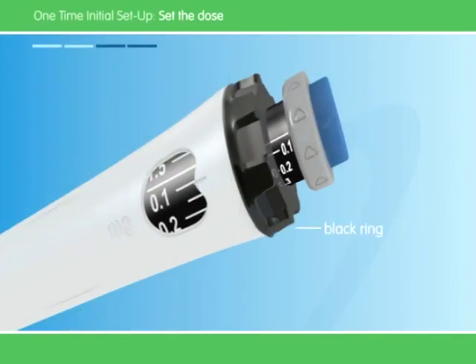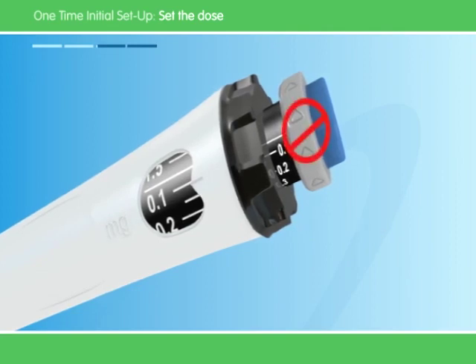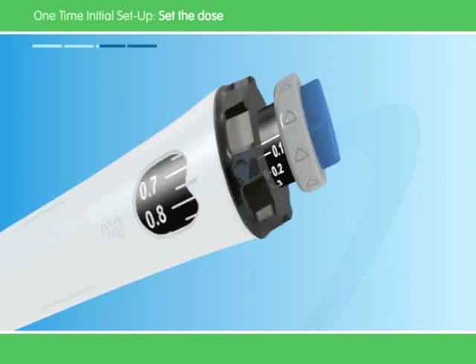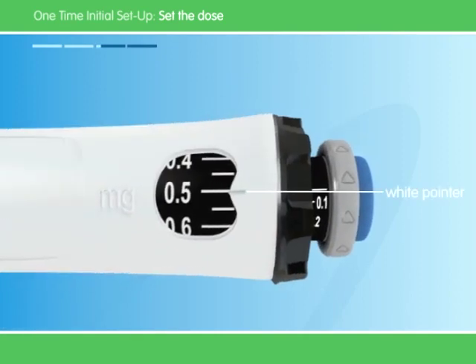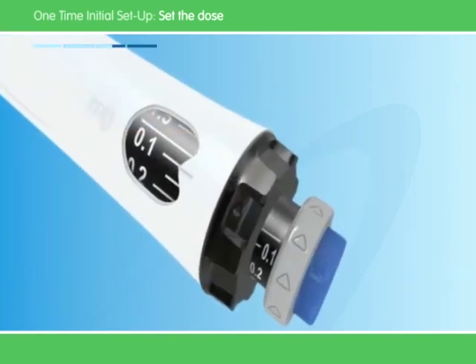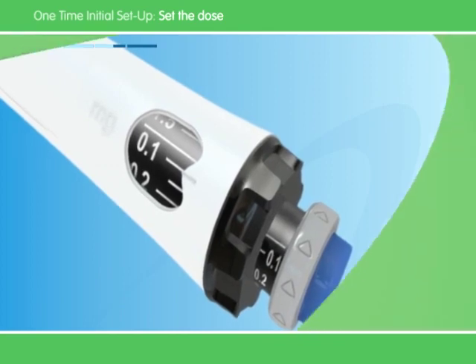Next, you must set the dose of the pen by turning the black ring. Take care not to turn the gray dial while you do this. Turn the black ring until the right dose lines up with the white pointer. Your doctor will tell you what your dose is. If you turn the ring past the white pointer, just turn the black ring back to the correct dose. Always check that you have the right dose — it's very important that you don't change the dose unless your doctor tells you to. Sometimes the black ring doesn't turn. Don't worry if this happens — just push the injection button again until it stops clicking, then try to turn the black ring again.